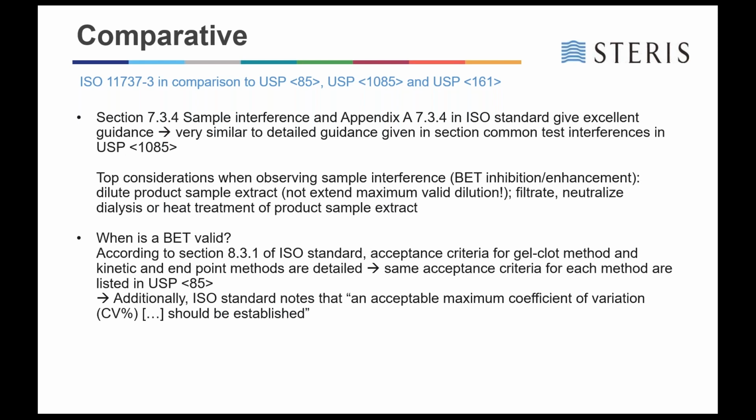The ISO standard gives also small, let's say, additional criteria and just points out that one should consider an acceptable maximum for the coefficient of variation within this test assay.